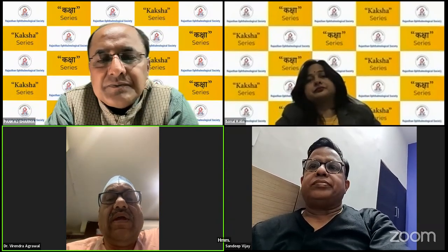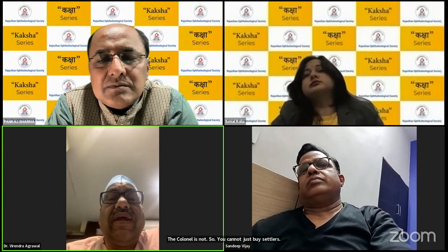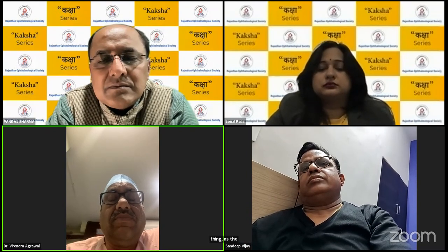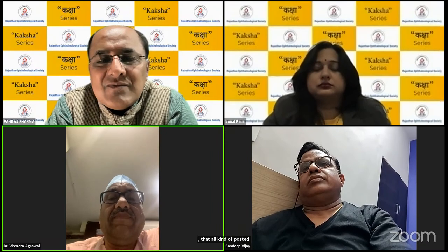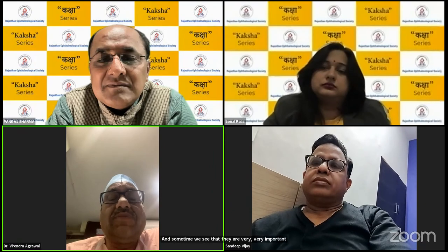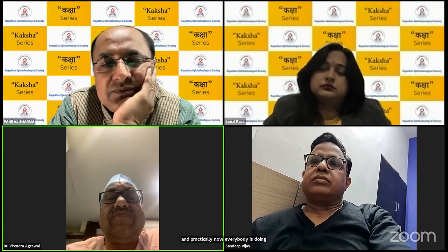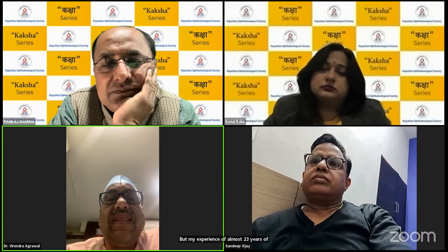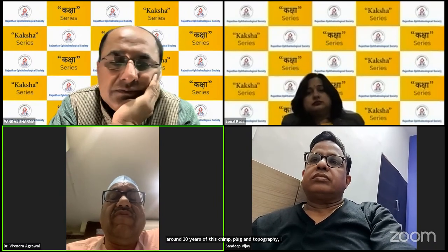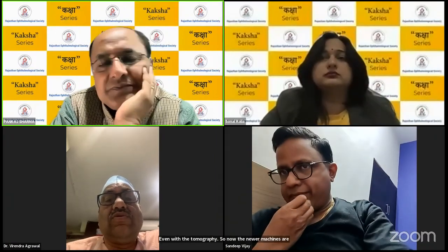And another thing, as Pankaj said, for refractive surgery, all kinds of posterior keratoconus, if missed, can actually cause complications. Practically everybody is now doing Scheimpflug imaging, but with my experience of almost 23 years of topography and around 10 years of Scheimpflug and topography, I still feel that topography is very, very important even with the tomography. So now the newer machines are coming with the combined thing.